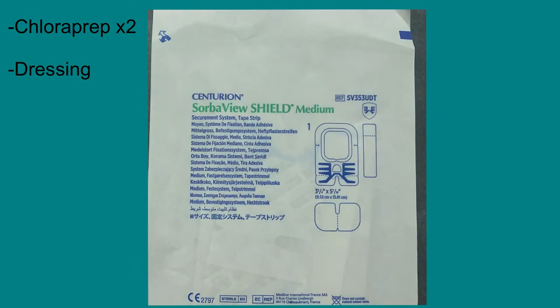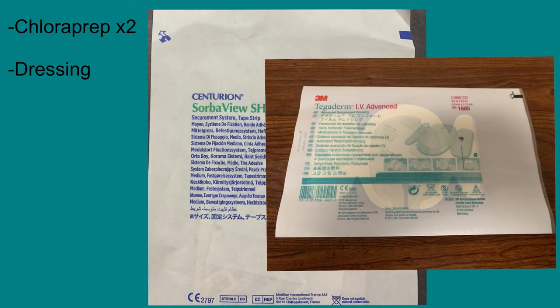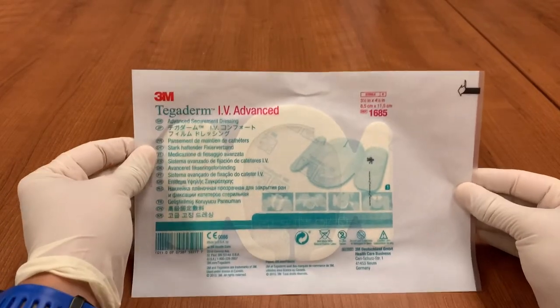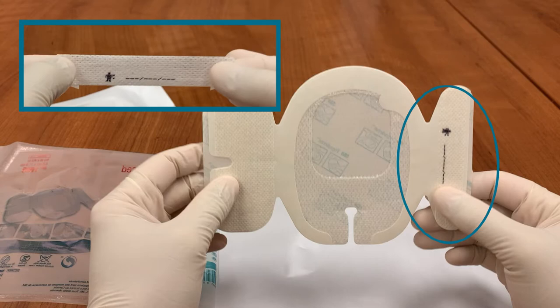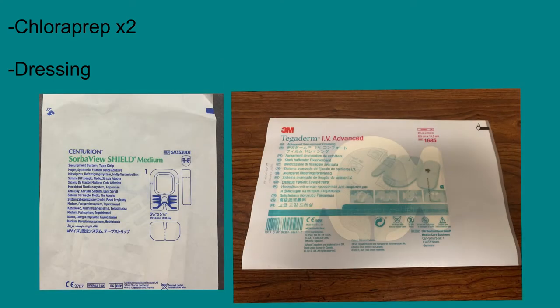There are also a few options for the dressing itself. This video will demonstrate the use of the SorbaView dressing, but the process is the same for the Tegaderm IV Advance. They are both three-piece dressings that act as a securement device as well. They are composed of the shirt, or the large windowed portion, the pants that fit in the bottom of the shirt, and the belt that secures the line over the pants. It is also possible to use a basic Tegaderm for a sterile dressing, but these other options are far superior as securement devices to keep the line safely in place.